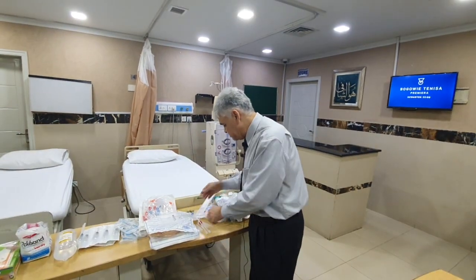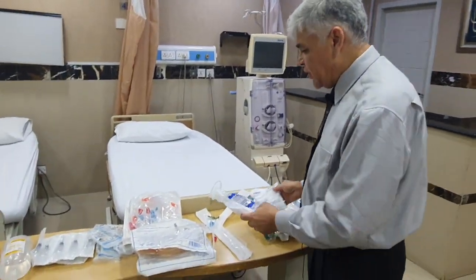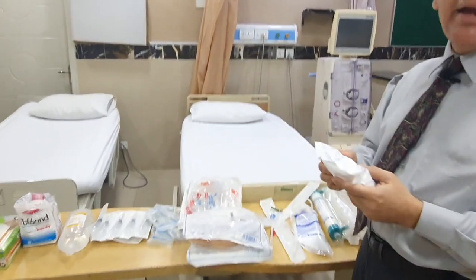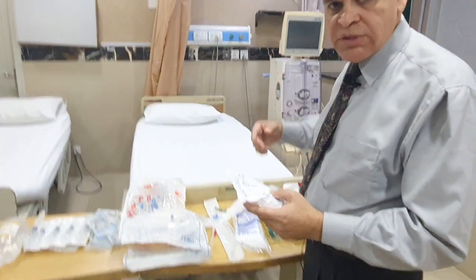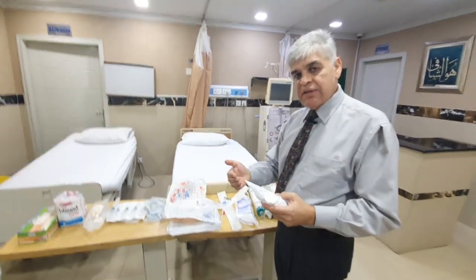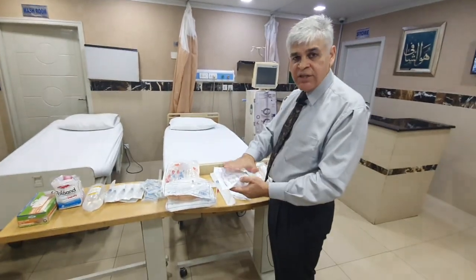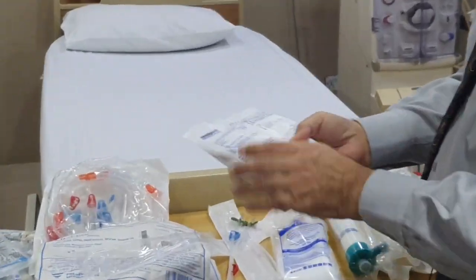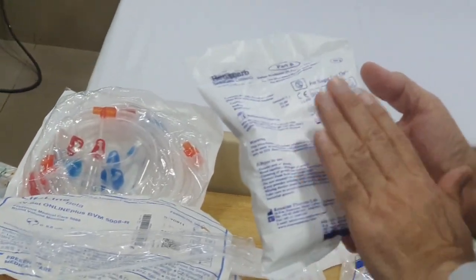The next one is the bicarb solution. Now this is very important, because this is actually what mixes in the machine. So the bicarb mixes in the machine, and this is what goes inside. The patient's blood is cleaned, and fresh things go in. Now this is a standard bicarb for a single machine, for a single unit.